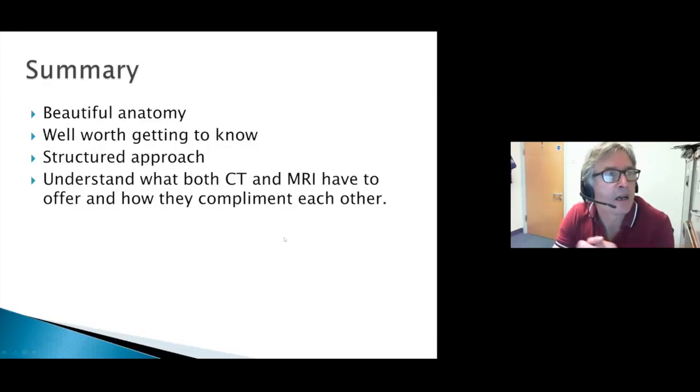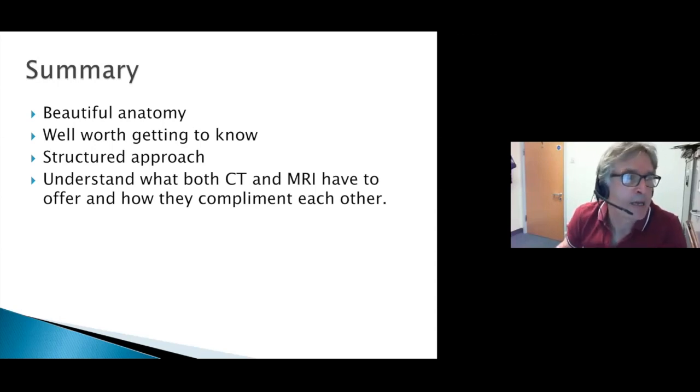So in summary, we have beautiful anatomy. It's well worth getting to know. I still think it's one of the great anatomical areas of the body. You do need a structured approach to be able to get to grips with it. But the great thing about the anatomy is that once you know where everything is, you can understand more the pathology that tends to occur there. And it makes diagnosis, or at least creating a differential diagnosis, that much easier.